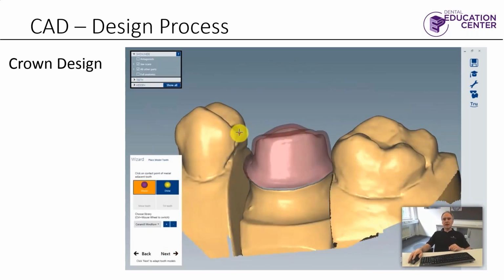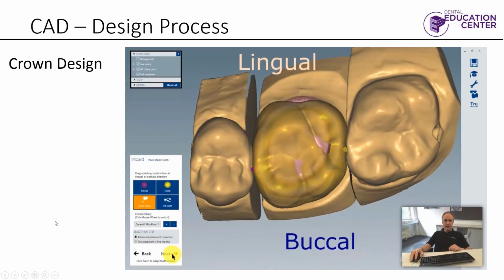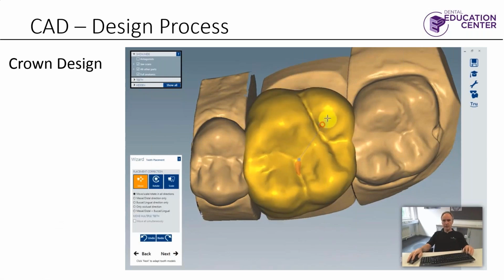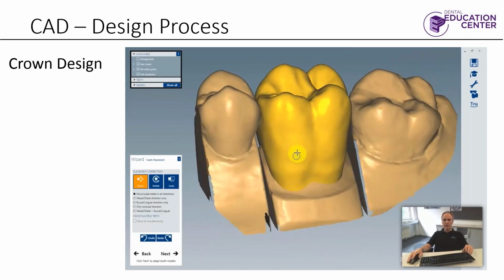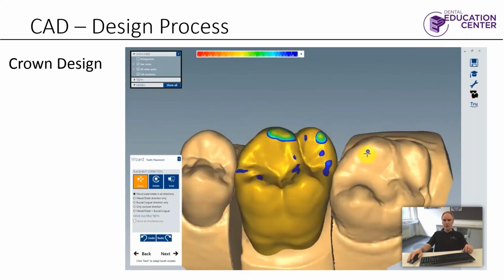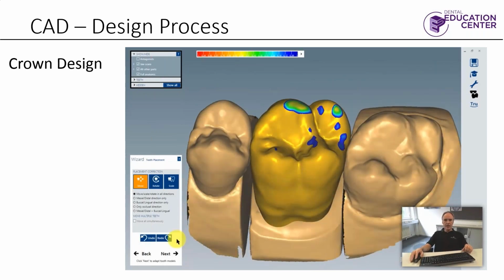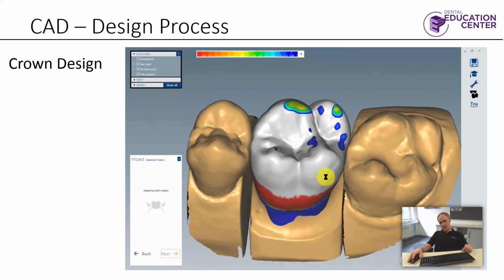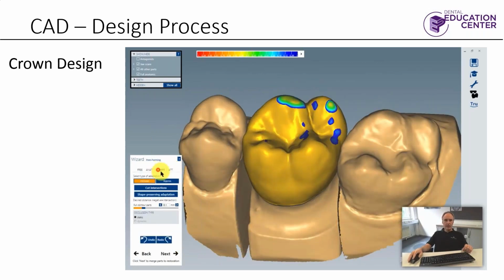Then in the next step, I will click on the mesial and distal contact point to add my library tooth. In the next step, I can adjust it a little. You see my hand to increase with shift, to tilt it or make it in another direction with the control key, and arrange some contact points with my visualization of the intersections. Then in the next click, the adapting of the crown to the margin line, with the possibility of adapting occlusal and the approximal contacts and the intersections.